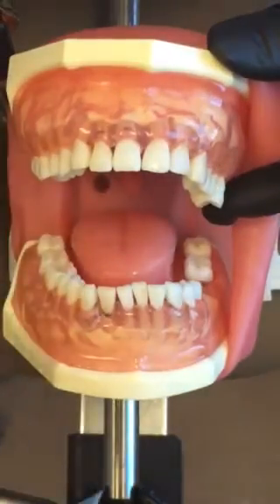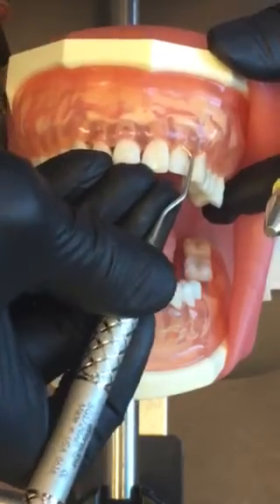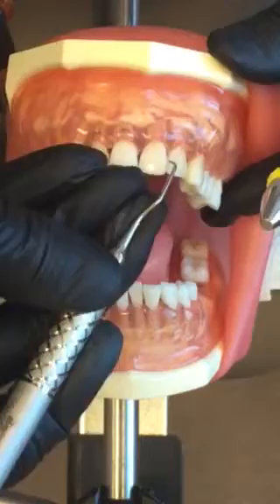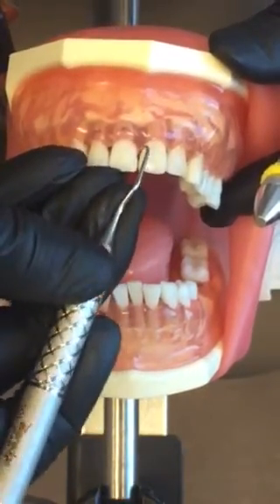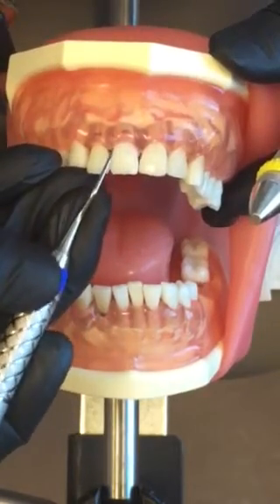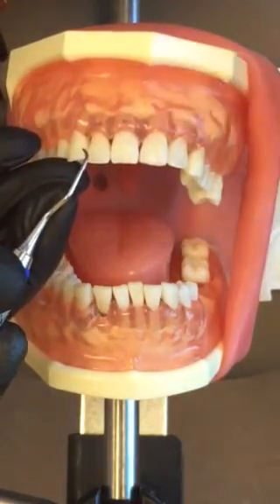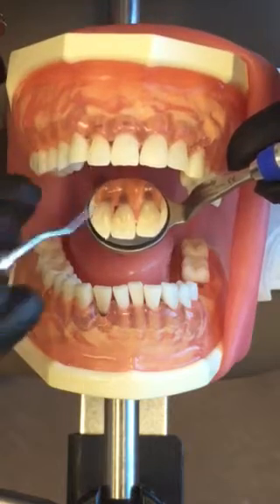And I can flip ends and then do the surfaces back towards me. So again I'm going to start midline and roll — midline and roll. Remember what I'm using on the surface towards me on the maxillary facial is going to do the surfaces away from me on the maxillary lingual.